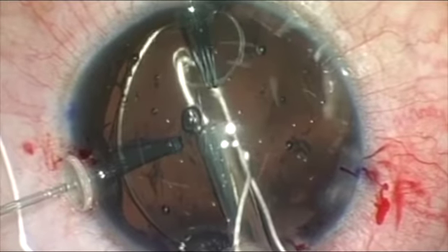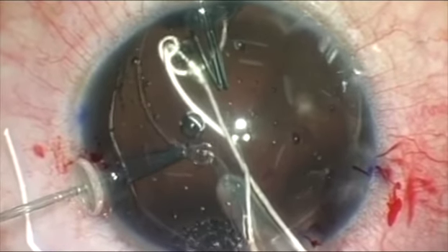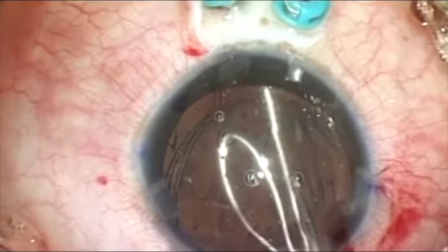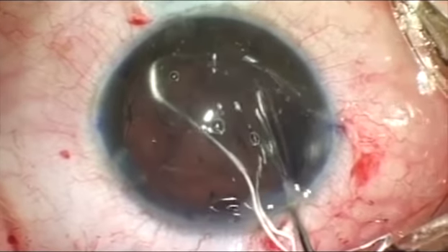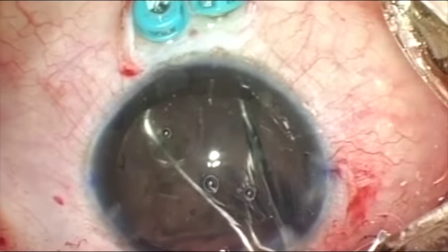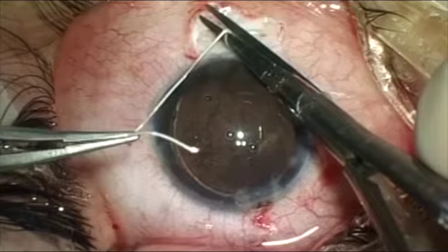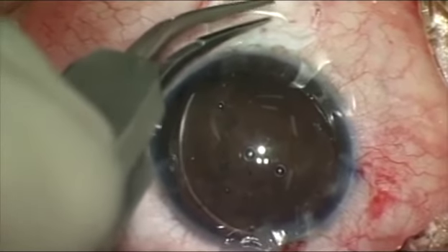Gore-Tex suture will be passed through two 25 gauge vitrectomy ports introduced 2.5 millimeters from the limbus. 25 gauge forceps are used to grasp the tip of the suture and retrieve the suture from the eye. This is the other end of that suture, again grasped with the 25 gauge instrument introduced through one of the ports. The suture is tied, the ends are trimmed, and the knot is rotated inside the eye.